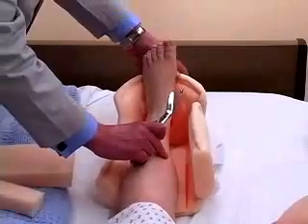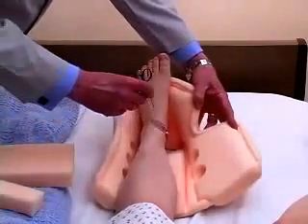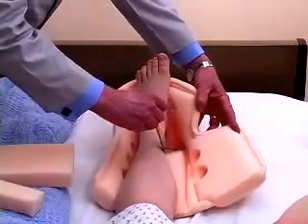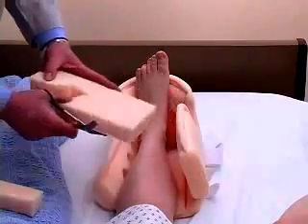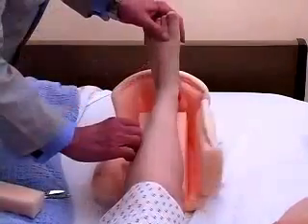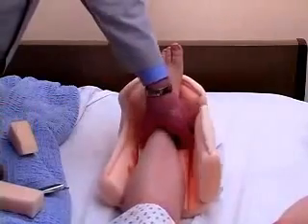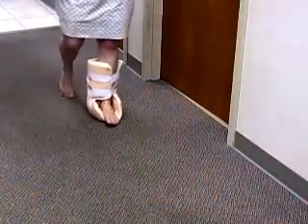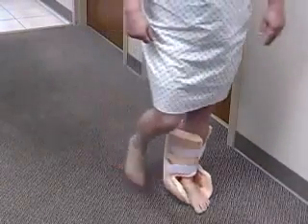Then the leg can be repositioned back into the boot, where it is now apparent that the entire area around the Achilles tendon has been relieved of any pressure. The alternative is to cut a V or U from the spare pad, remove the paper backing, and apply the pad so that the patient again has complete relief around the Achilles tendon. Walking short distances while wearing the boot is permitted. However, walking longer distances should be done only with the assistance of a caregiver.